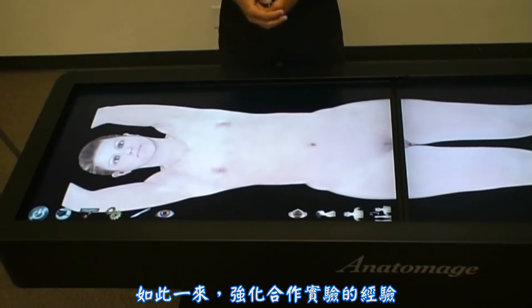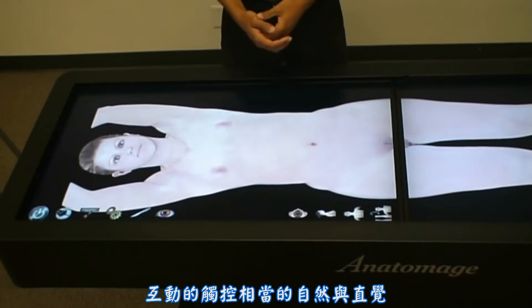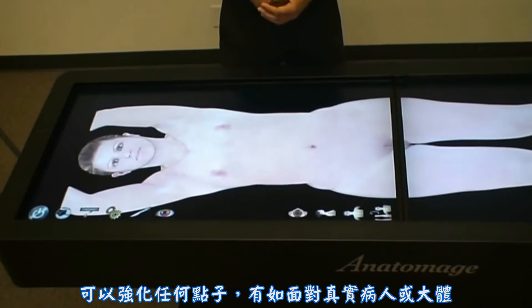In this way, it strengthens a collaborative learning experience and provides a feeling of being in front of a real cadaver or a patient. The touch interactivity is natural and intuitive, again strengthening the idea of being in front of a real patient or a cadaver.